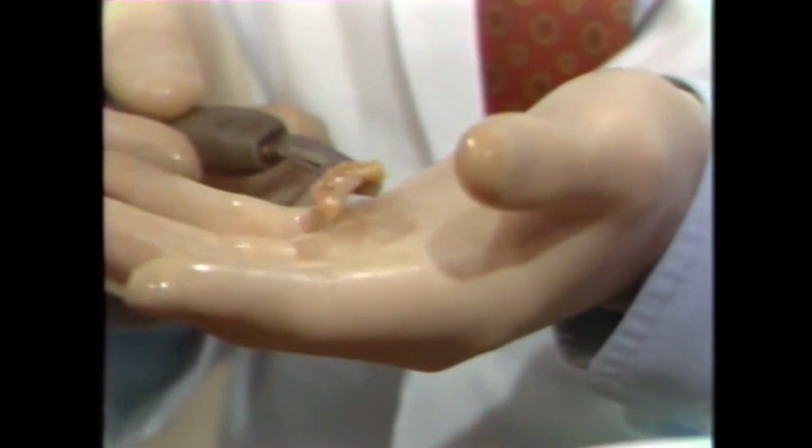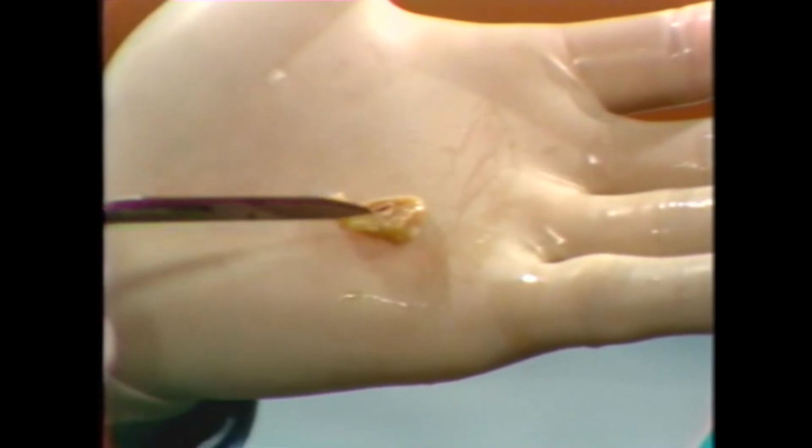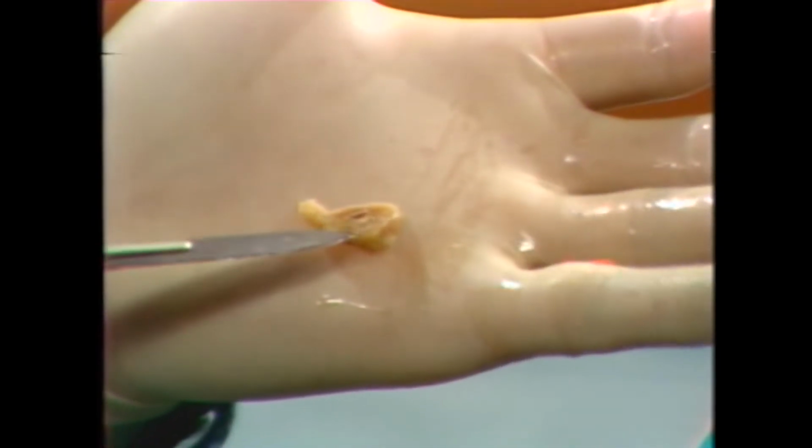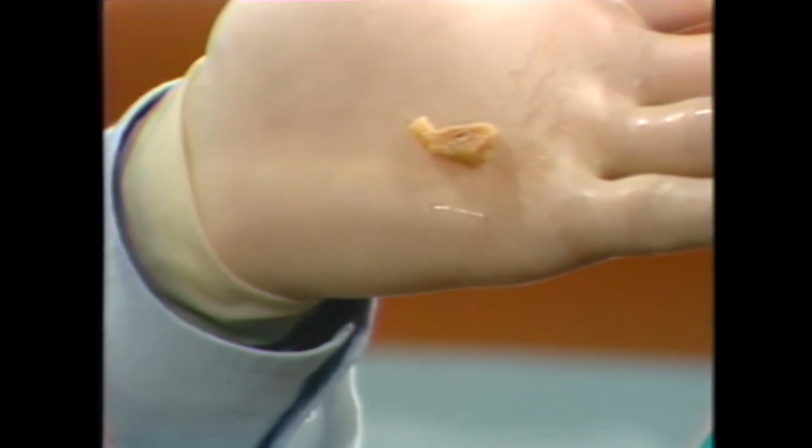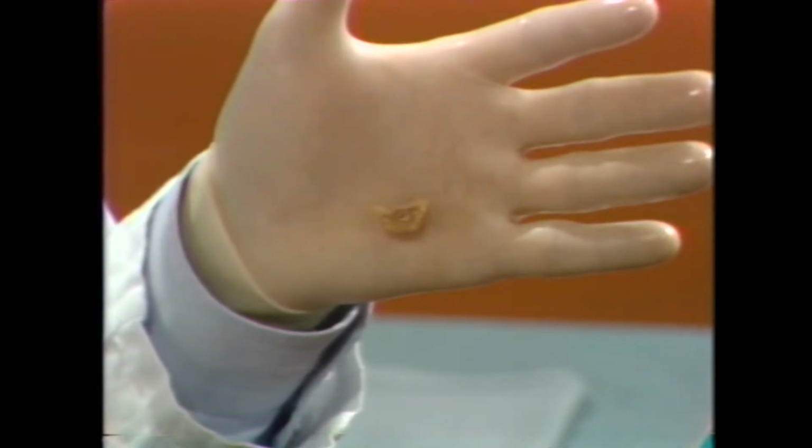Now here, of this segment of about 7 or 8 centimeters long, there's only one segment of 5 millimeters or so that has any luminal narrowing of any significance in it. And the lumen here, I would judge between 51 and 75% narrowed. The residual lumen is eccentrically located. I don't know if you can see that.